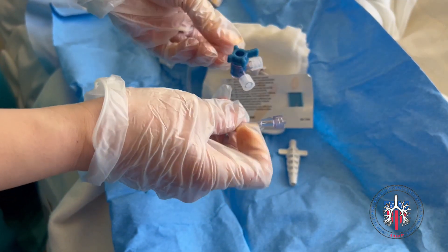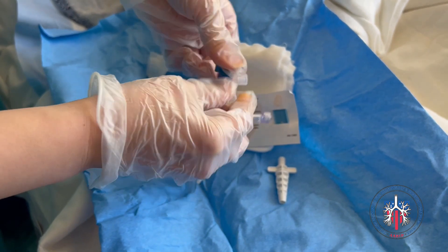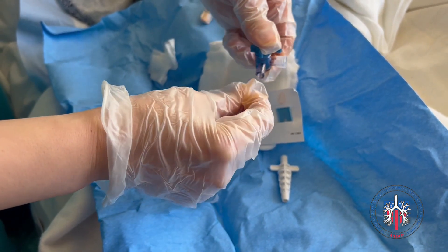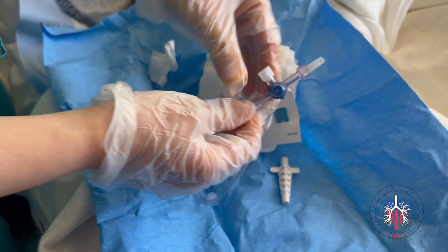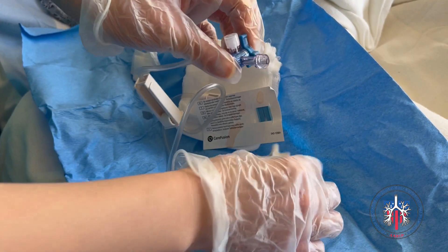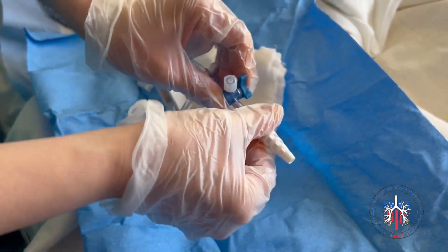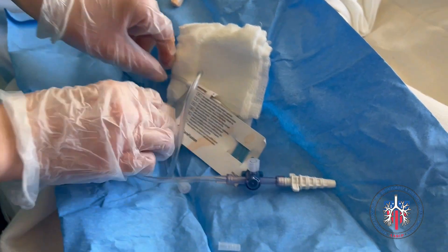First, connect the three-way stopcock to the drainage line with lockable access tip. Then connect the other side of the three-way stopcock to the drainage line adapter. Alternatively, you can connect the drainage line with lockable access tip directly to the drainage line adapter.